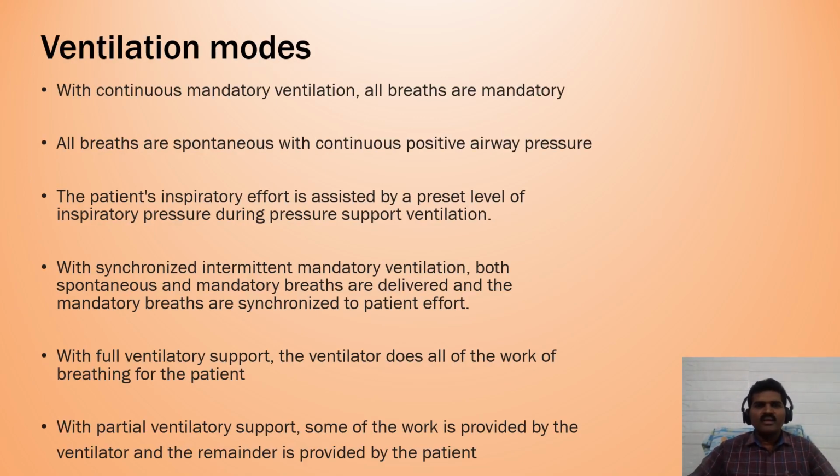Ventilator modes. With continuous mandatory ventilation, all breaths are mandatory. All breaths are spontaneous with continuous positive airway pressure. The patient's inspiratory effort is assisted by a preset level of inspiratory pressure during pressure support ventilation. With synchronized intermittent mandatory ventilation, both spontaneous and mandatory breaths are delivered, and mandatory breaths are synchronized to the patient's efforts. With full ventilatory support, a ventilator does all the work of breathing for the patient. With partial ventilatory support, some of the work is provided by the ventilator and the remainder is provided by the patient.